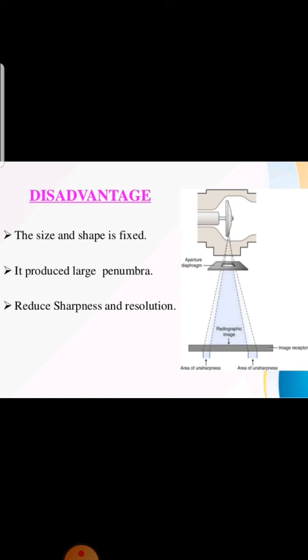And that area would be left unexposed, and definitely you won't get enough information on your image. So it's very important to place it properly. And another application is dental radiography, as I have told you earlier.